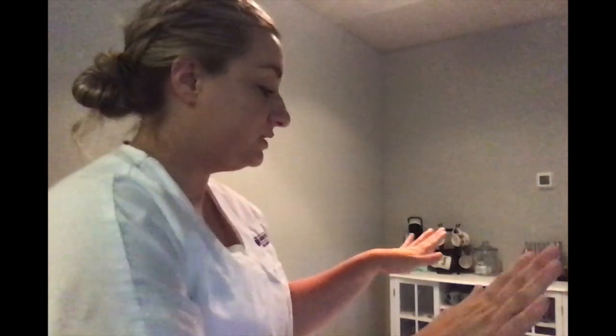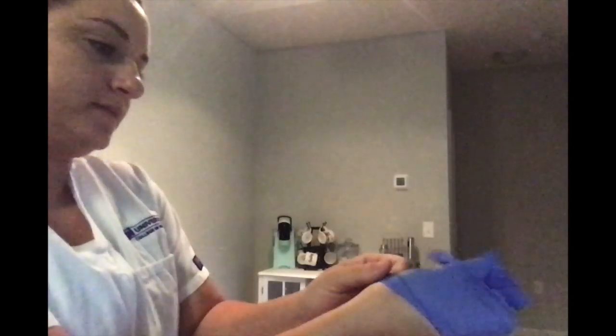Then I'm going to set the bed to a working height, and I'm going to wash my hands again, and I'm going to put on my gloves.